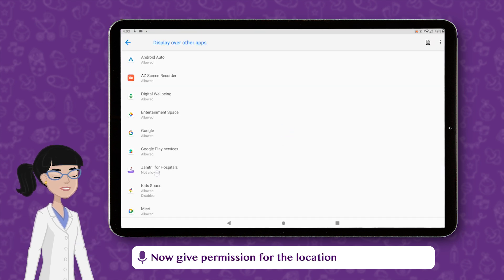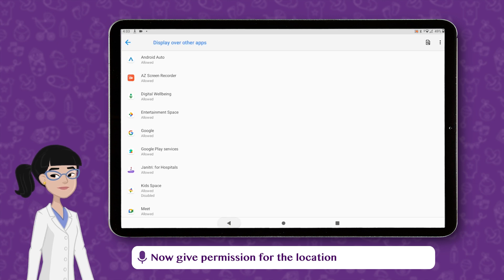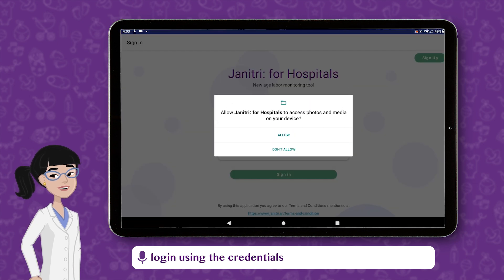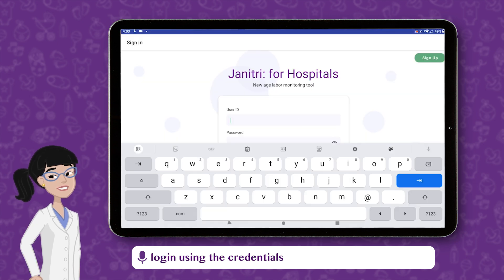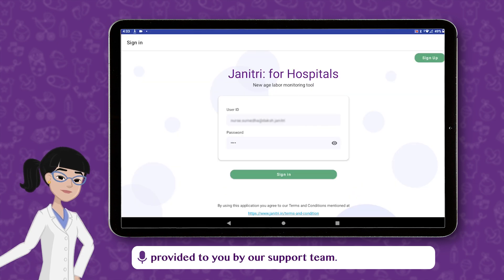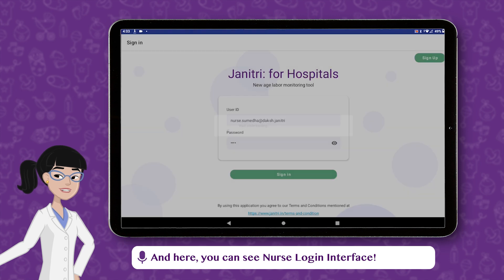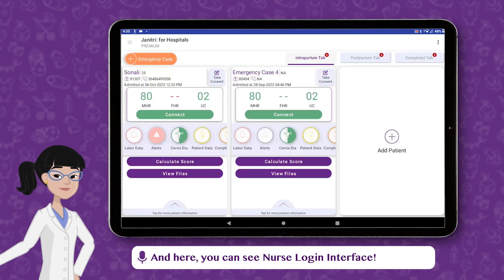Now, give permission for the location, log in using the credentials provided to you by our support team, and here you can see the Nurse Login Interface.